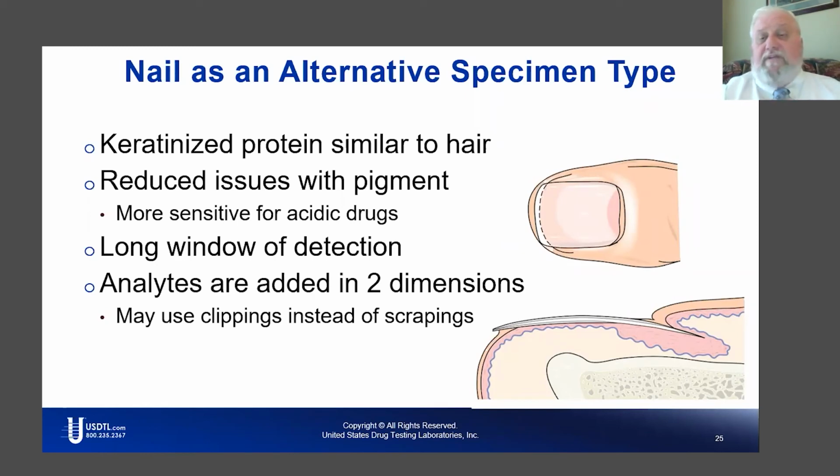And one of the things we have to keep in mind is that they are different. They give you similar results, but there are differences. Now, the accuracy of these are the same as any other test. They're in a chain of custody. We have an initial test, generally immunoassay. They're confirmed by mass spectrometry. So for false positives, we have a lot of measures and checks and balances in place to mitigate that.